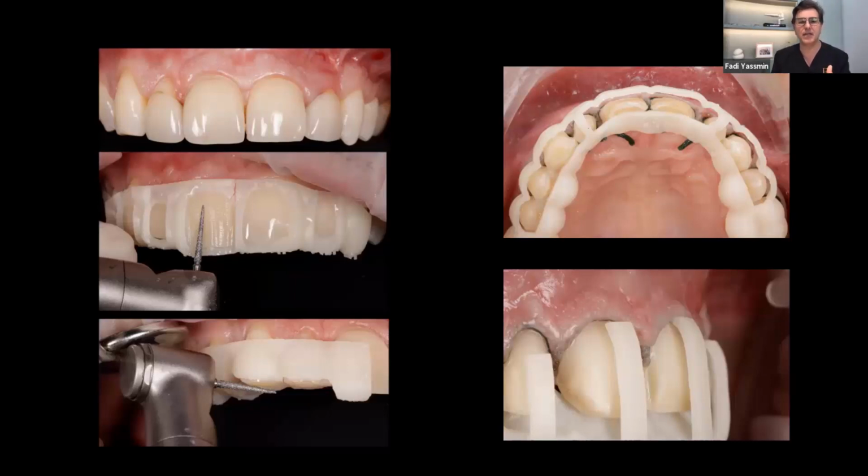Now, this is the control guide. So we've decided we're going ahead and we're actually going to do the work. Then there's a whole series of things to get you to achieve that, aesthetically, from reduction to the gum, all these things. Again, these are tools, and the more tools you have, the more likely you will achieve the final result.